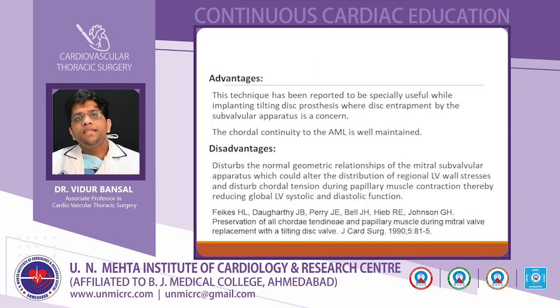So, the advantage of this technique is that it has been reported to be specifically useful while implanting tilting disc prostheses. Currently we are using bi-leaflet prostheses. So, this technique was specifically useful while implanting the tilting disc prostheses, where disc entrapment by the subvalvular apparatus was a concern. Also, the chordal continuity to the AML is well maintained in these cases.